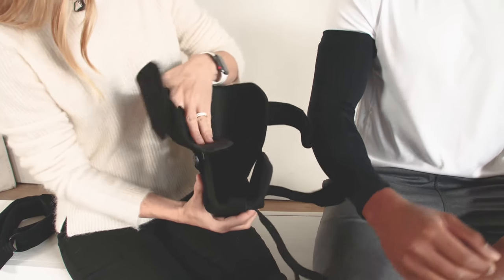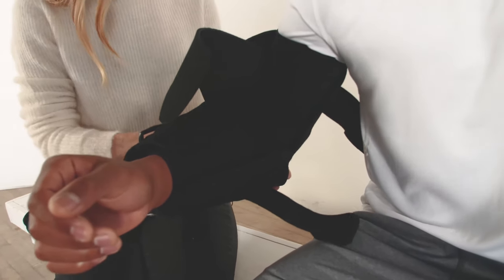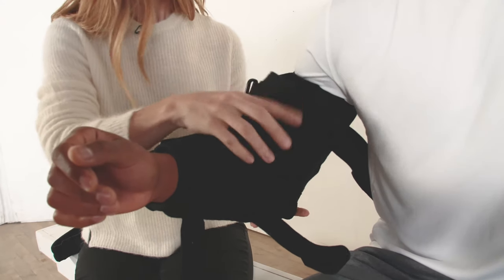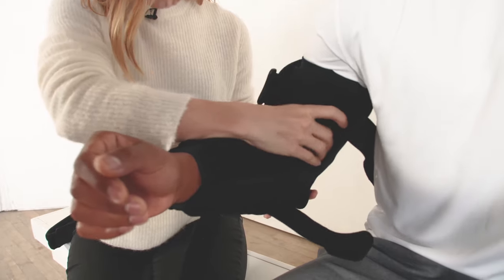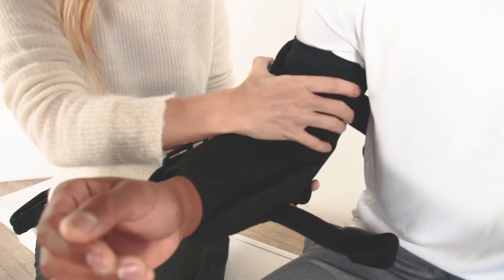Next I'm going to set his arm into the brace. I want to make sure that his elbow is seated down into the angle of the brace. Next I'm going to tuck the Sarmiento cuffs in, making sure that I have good coverage.